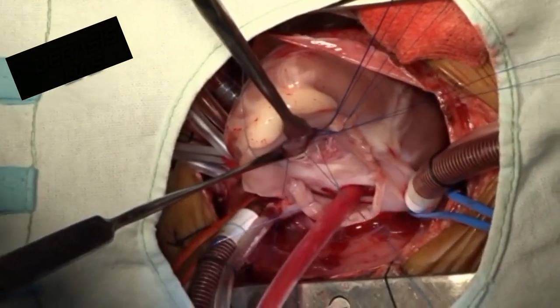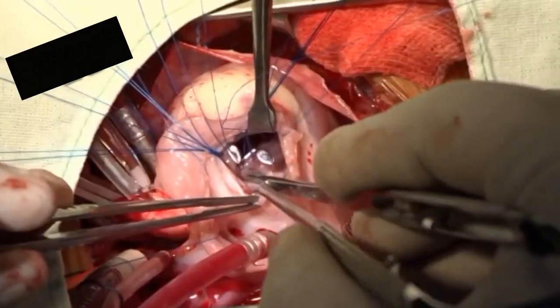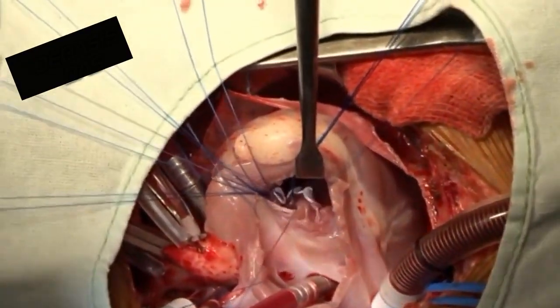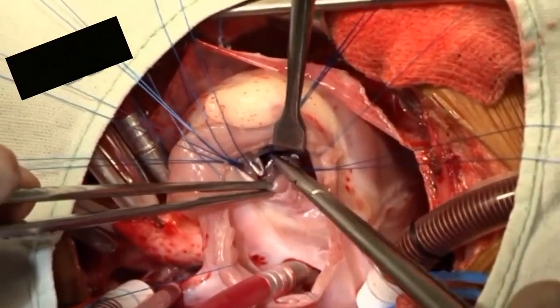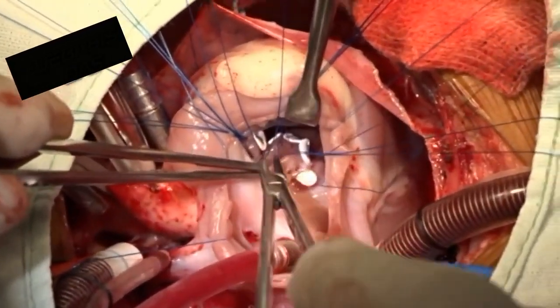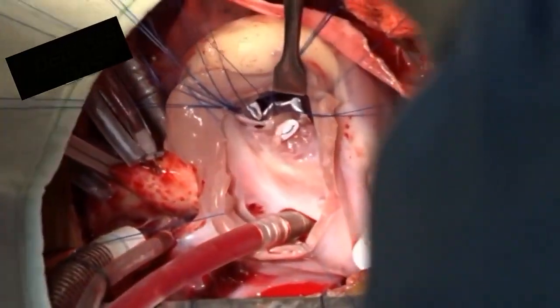Multiple interrupted pledgeted sutures are passed through the VSD margin. At this stage, we are taking the sutures through the posterior-inferior margin of the VSD, and we have to be conscious of the bundle. The inlet portion of the VSD will be tackled later.